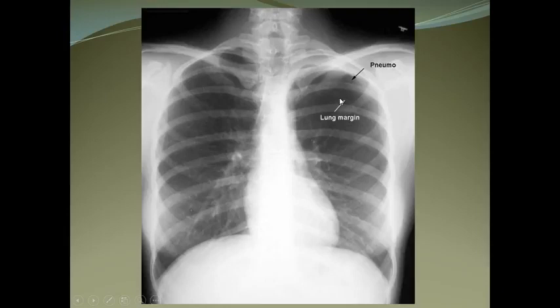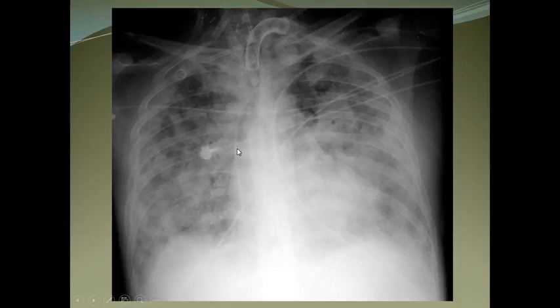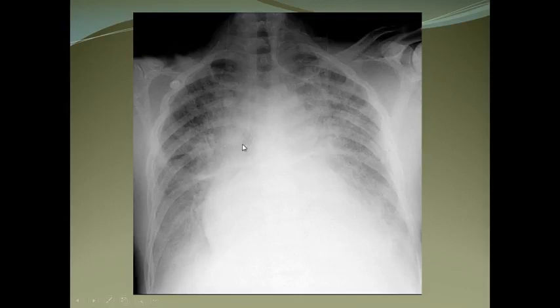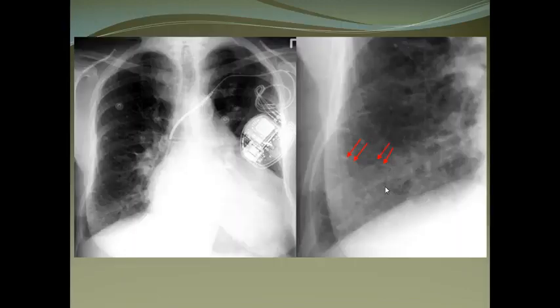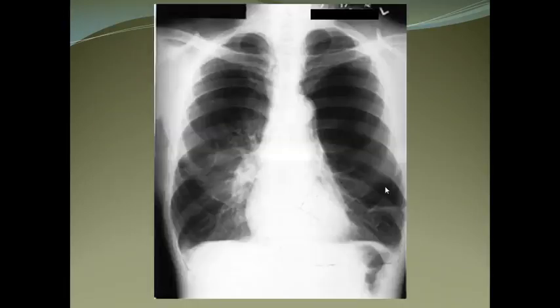Pulmonary edema: this is an AP chest X-ray — you cannot clearly see lung markings. There is white shadowing, congestive cardiac failure, a large heart with bilateral batwing appearance, some pleural effusion, and Kerley B lines.